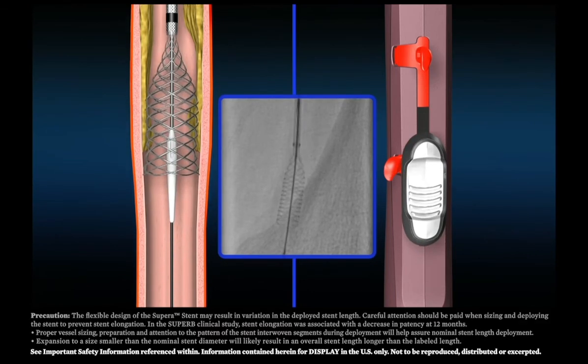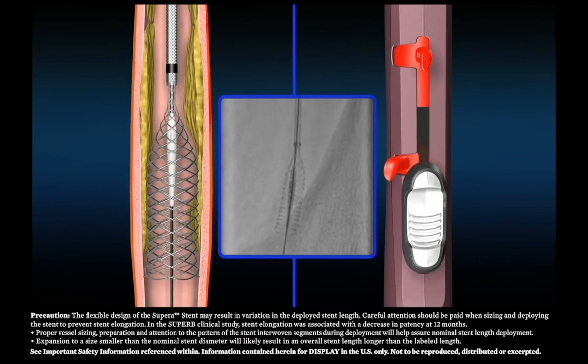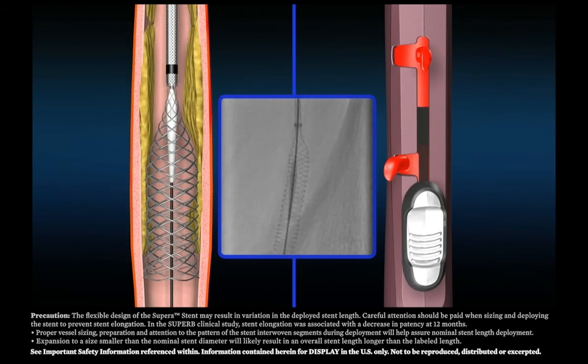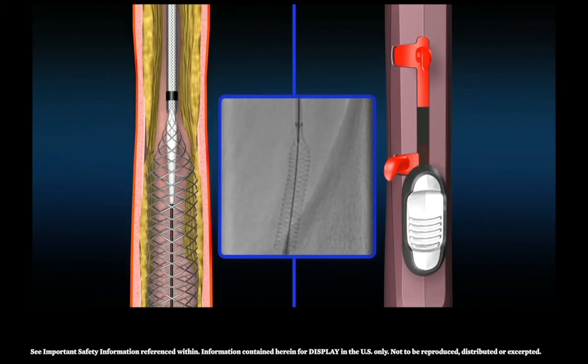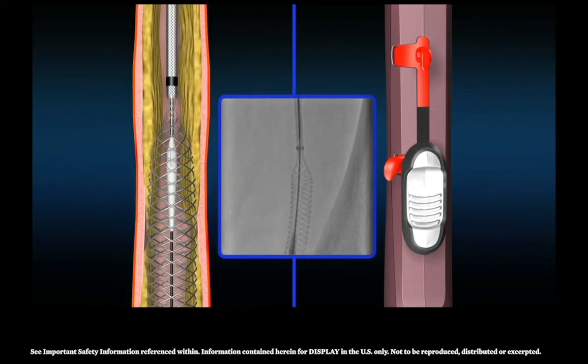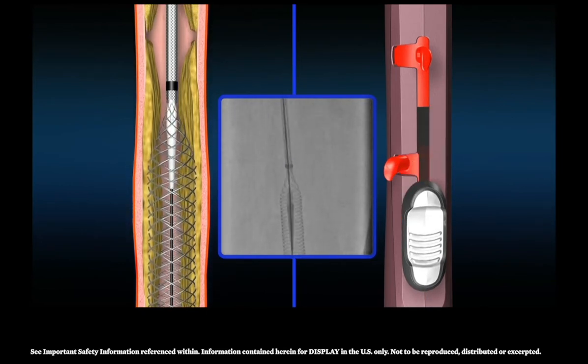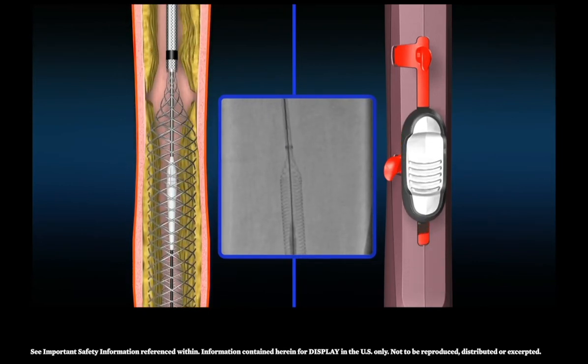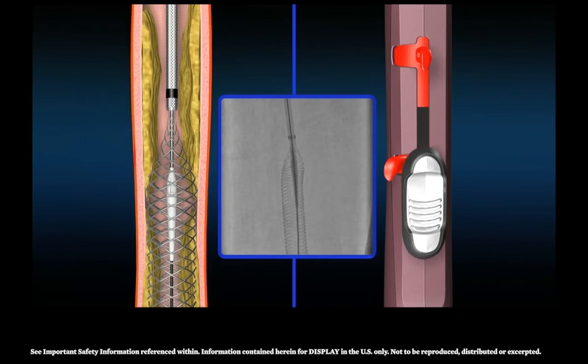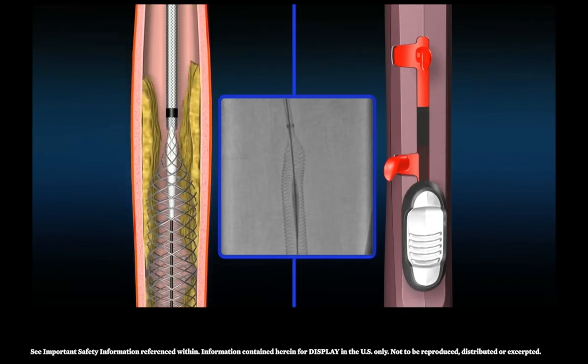Continue controlled advancement of the thumb slide under fluoroscopy. Each full advancement of the thumb slide will only deploy a short section of the stent. Shorter thumb slide advancements may provide greater control versus full thumb slide advancements. Fluoroscopic visualization and tactile feel will indicate the end of stent deployment.